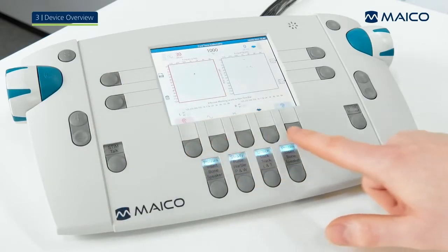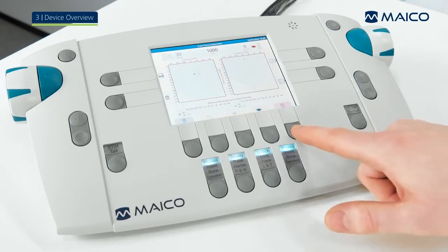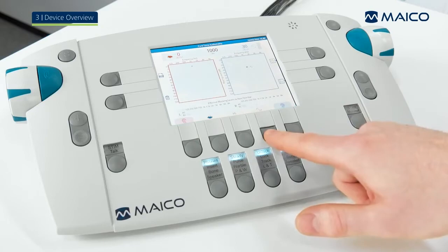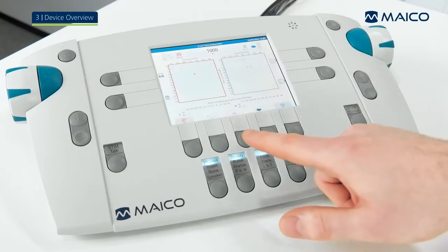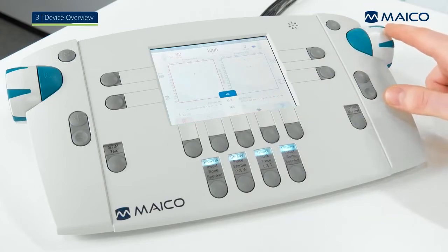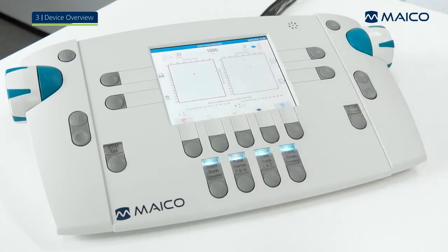The lower display function keys are used for the test navigation. It allows the ear side and the test signal to be set independently for each channel. In addition, each test screen has a test type key to select different test types, which is important for correct storing of results within the device.